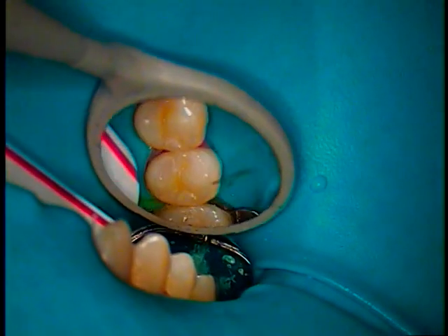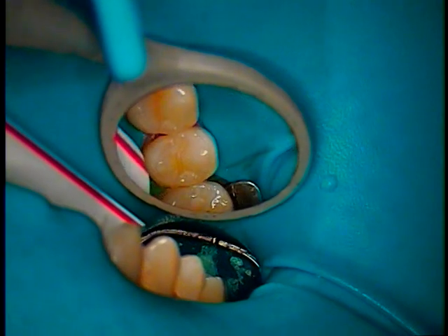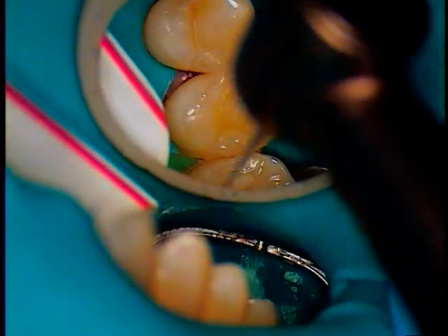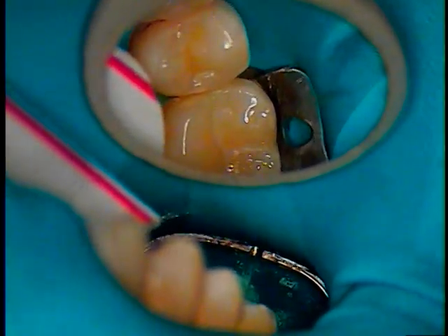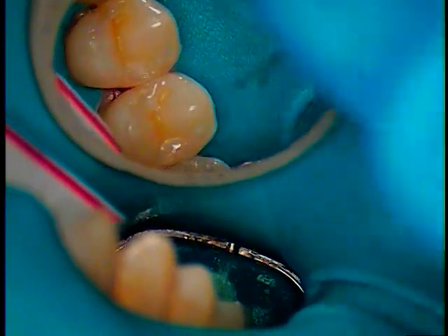Now I like to use a fine diamond when I come in. Okay, so here we go. I'm going to add a little bit of water here first. There we go. Okay. Have another mirror, please.